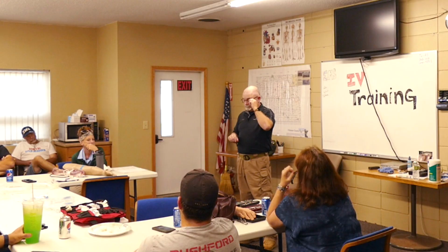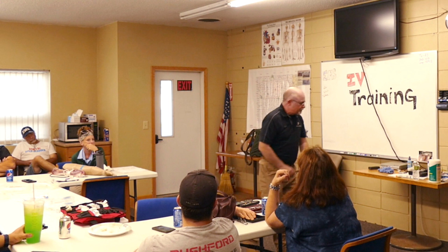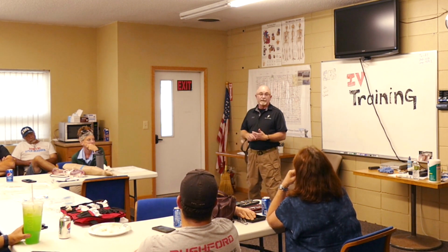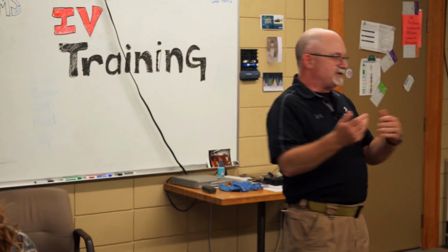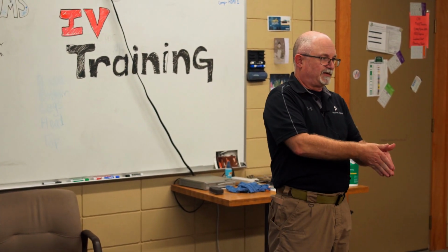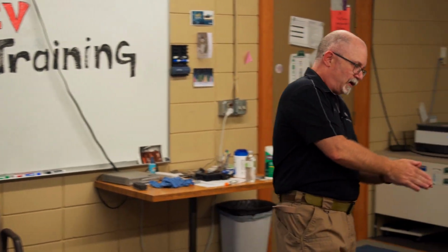Go ahead. I talked to a few ambulance groups around the county, and they say their protocol is if they can't get it in after 2 tries, they just go. And I would argue, get it on the way. So if you've got it bad enough, yeah, absolutely. But that same principle, there's never an always and there's never a never. So just think about that. But is what you're doing going to make the difference right now? So think about that before.